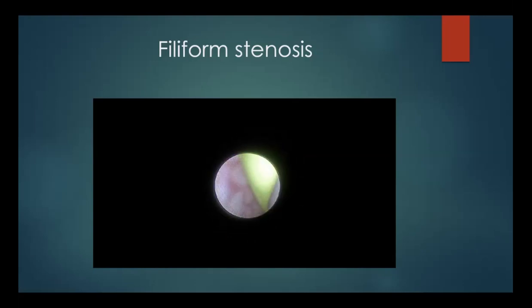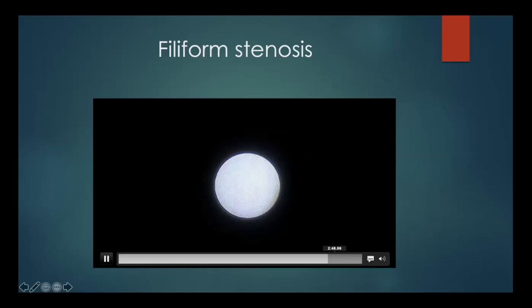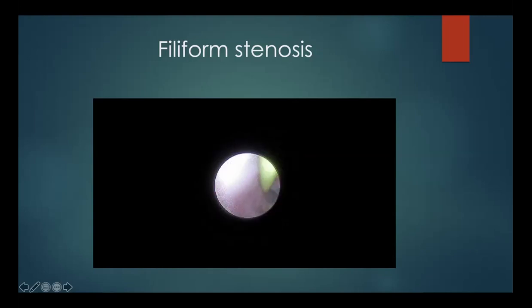At the end of the procedure, you can see that we have a nice dilated duct, and the patient is doing quite well now. You can see the final diameter where your web has almost been completely excised.